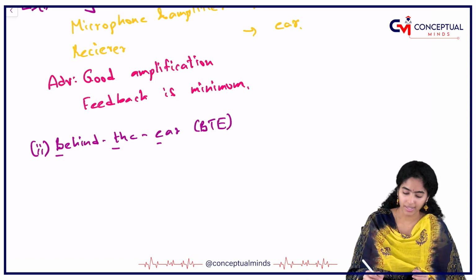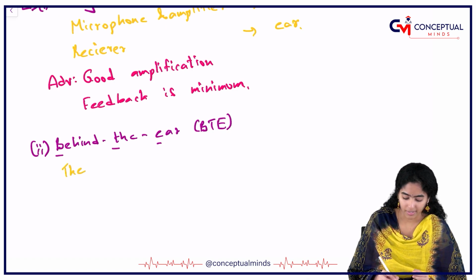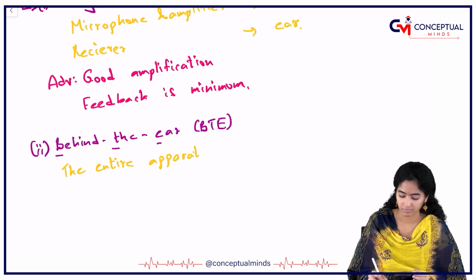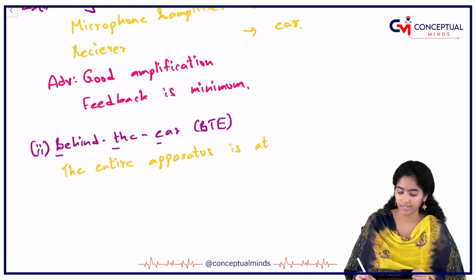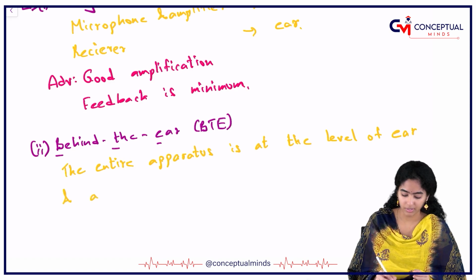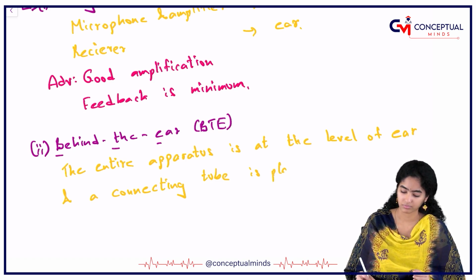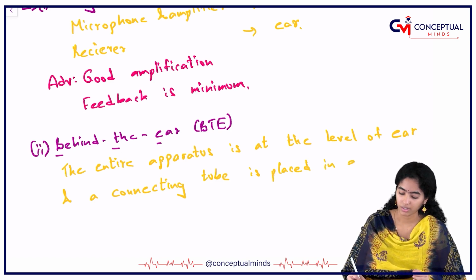Okay, in behind the ear, the entire apparatus is at the level of the ear, and a connecting tube is placed in the ear canal.